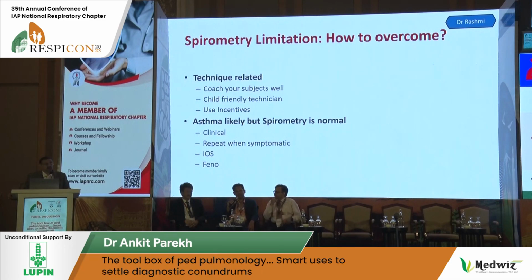So again, if the exhalation time is less but the rest has been done properly, it has been a good start, the back extrapolated volume is fine and everything else is okay, then FEV1 can still be interpreted. The rest of the values cannot be used.